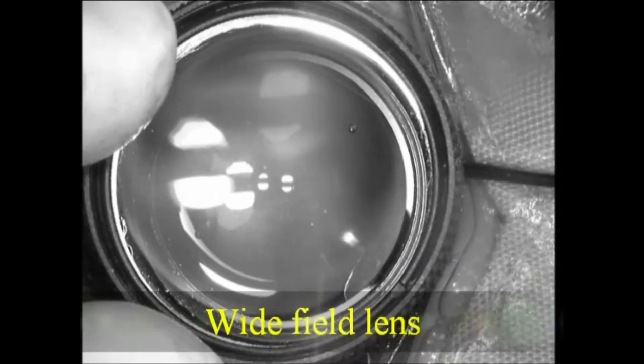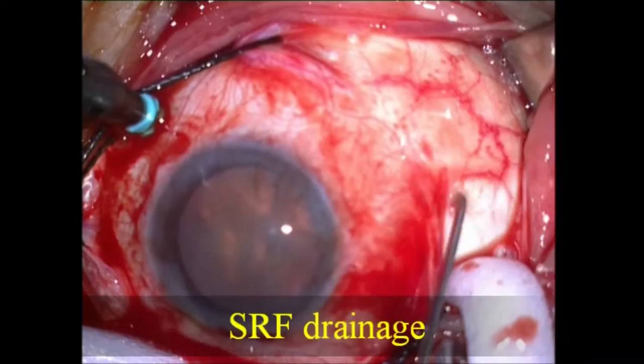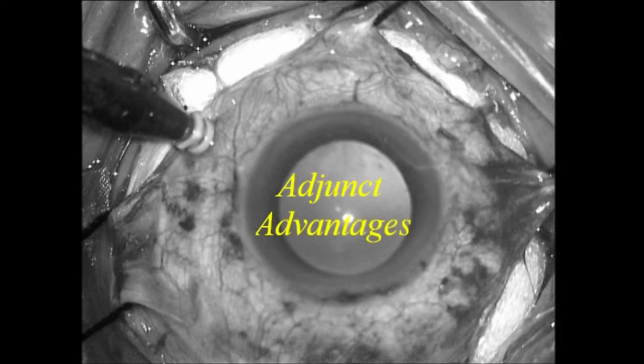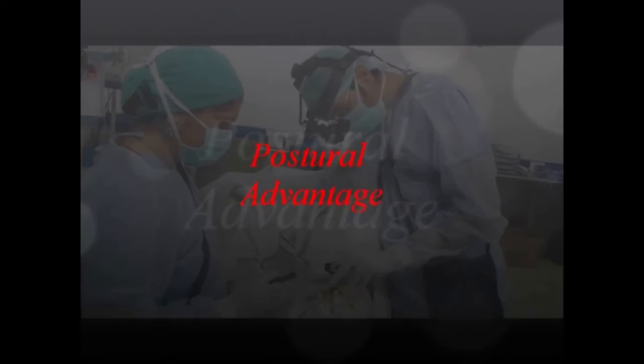By using a wide field contact lens and chandelier illumination, one can get a great overall view of the fundus to carry out all the steps of buckling surgery. Another advantage of this technique is zooming capability, which is not possible with indirect ophthalmoscopy.